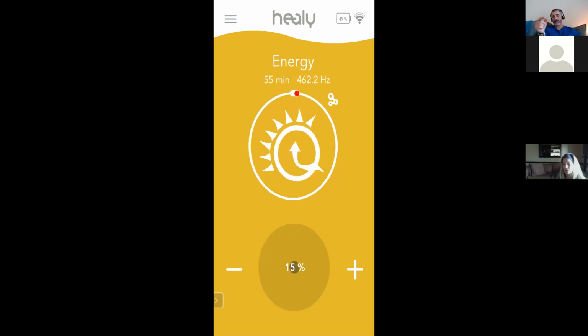Right now, it is connected, right? But for example, if I unsnap this device, it goes to black. That's because there's no connection, right? Or it goes back if I had it maybe too loose, right? Also, right now I'm using the new silver straps, which have really good connectivity, okay? And sometimes if I push on it, it will connect again, right? So if I turn this up, I usually use about 35%, right?